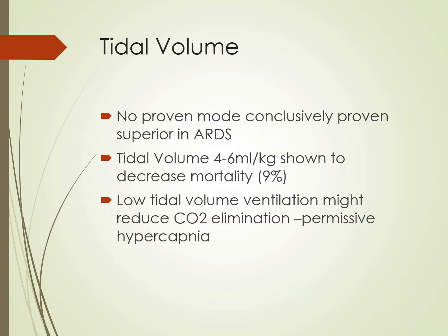So you have a patient with ARDS, and you want to know what kind of tidal volume to set. Actually, no particular mode is better than another mode. So SIMV, assist control, and so on. The best modes are how you manage it, how the therapist manages. So the ideal tidal volumes you want to use are anywhere from 4 to 6 cc's per kilogram. And the reason for that was there was a greater reduction in mortality in these patients.